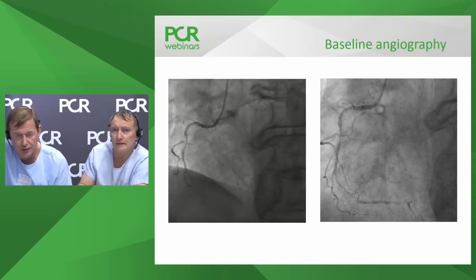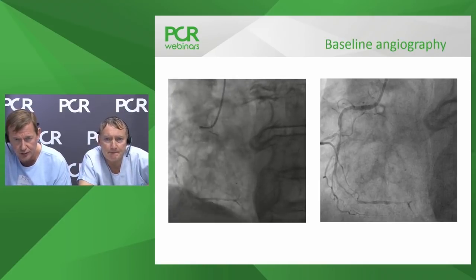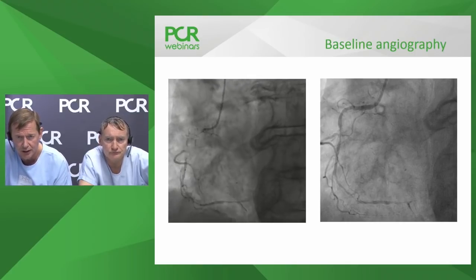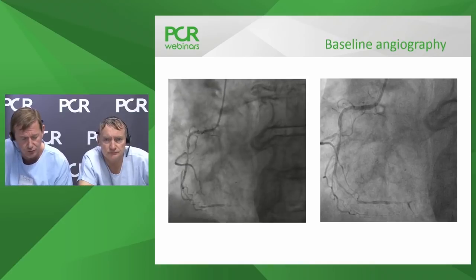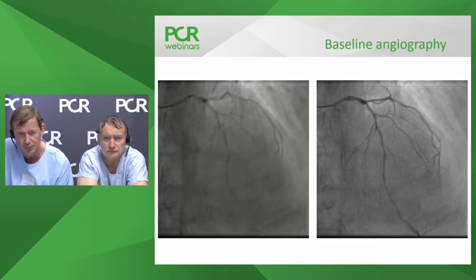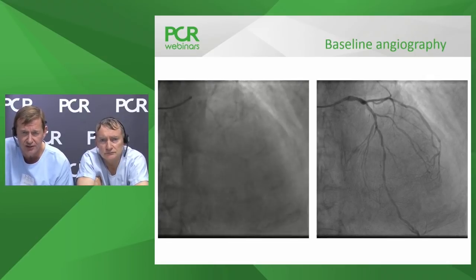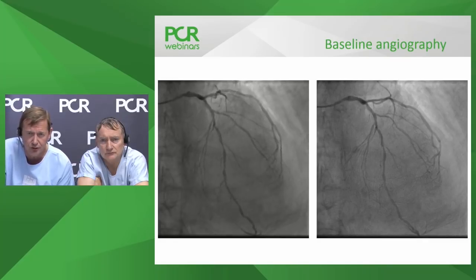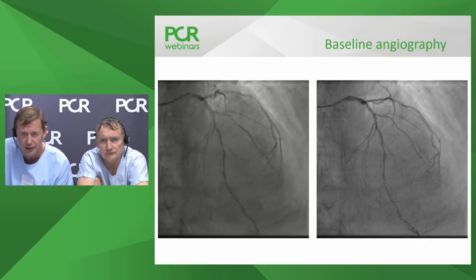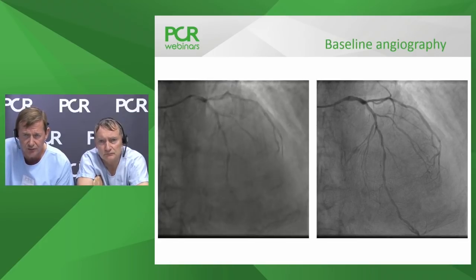Okay, so on the coronary angiogram, you can see a severely diffusely diseased right coronary artery, which peters out and has a subtotal occlusion in its distal course. The inferior wall is compromised on the echo. And here is a diffusely diseased LAD, perhaps some concern with the proximal vessel, some involvement with the left main. And before the dye goes in, you can see the extensive amount of calcification.